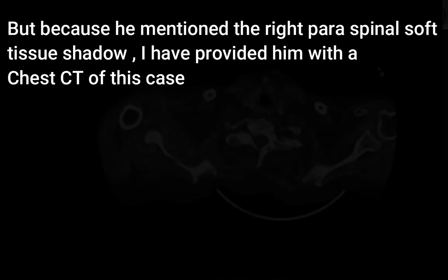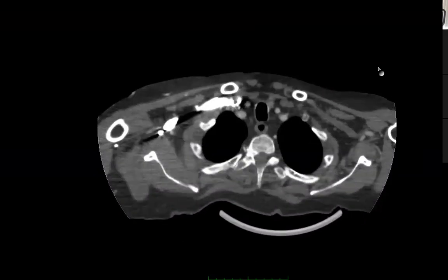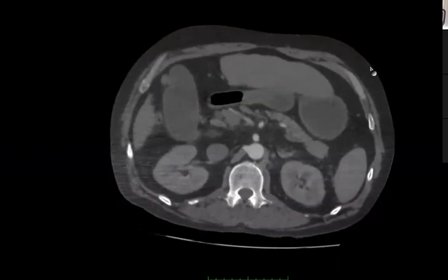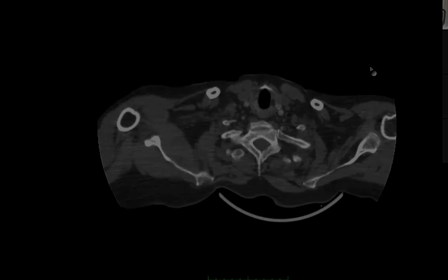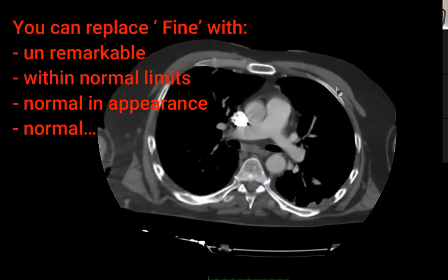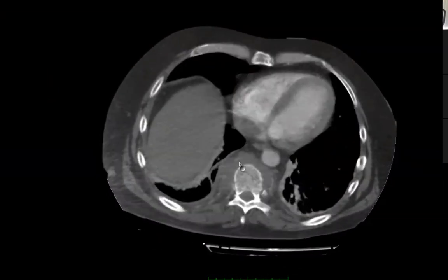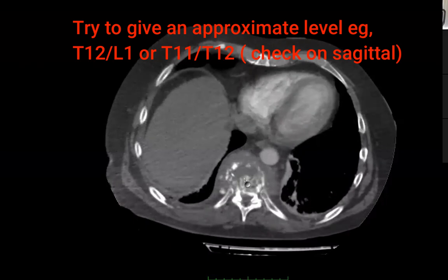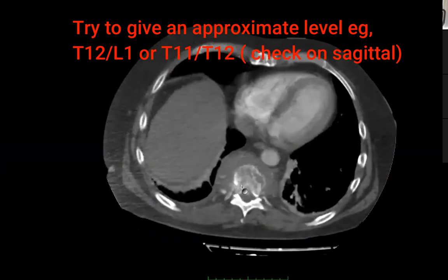So this is contrast-enhanced axial CT cuts of the chest and upper abdomen. Regarding the root of the neck shadow, it was either a projectional finding or it's not covered by this field of view — I think it's more of a projectional artifact. The vessels look fine. There is no obvious right paratracheal lymph node, so it was mostly due to the rotation. The main abnormality is the right paravertebral line — it's an aggressive-looking vertebral lesion destroying the lower thoracic vertebra with a significant soft tissue component.